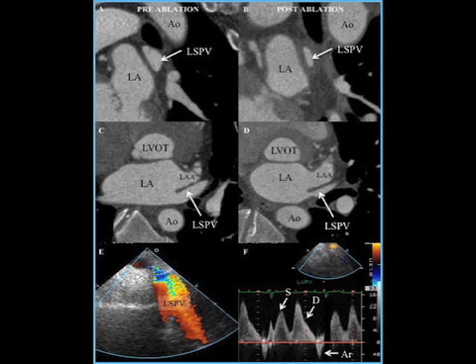By cardiac CT, we were able to identify 2 veins that had a mild stenosis. Similarly, TEE was able to find these two veins that had stenosis using a slightly different technique, a combination of anatomic narrowing, spectral broadening, aliasing, and a high flow velocity of more than 110 centimeters per second. The next illustration shows pulmonary vein stenosis of the left superior pulmonary vein, both by CT and by TEE. As you can see, by CT there was a marked area reduction, and by TEE you can see aliased flow and a high velocity of more than 120 centimeters per second.